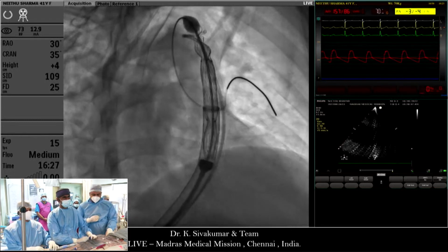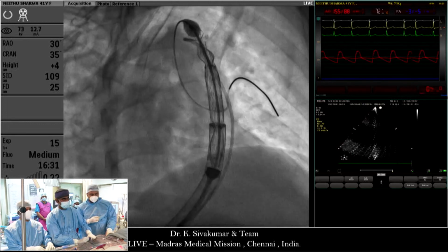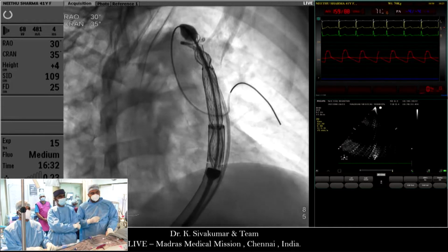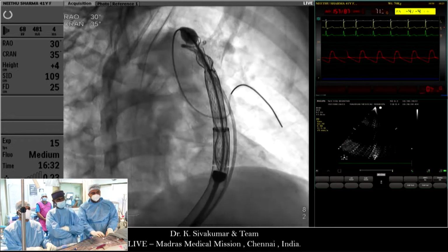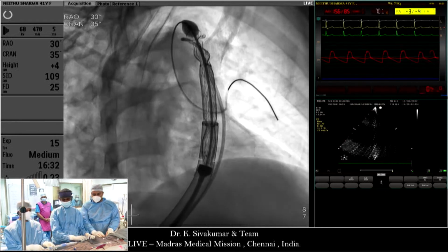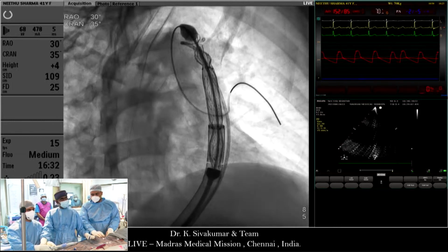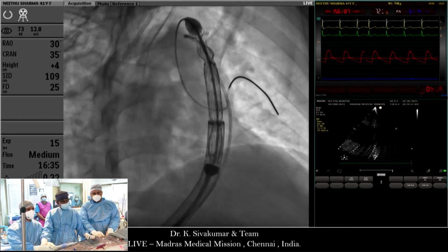If the sizing balloon doesn't move at all during balloon interrogation, then I may trust that. But if you want more confidence, you may use something like the PTS-X balloon, which is good for a balloon expandable valve, for example Sapien. If we still can see the waist with a 40 millimeter balloon, I think that also gives confidence that the waist is strong enough to hold.